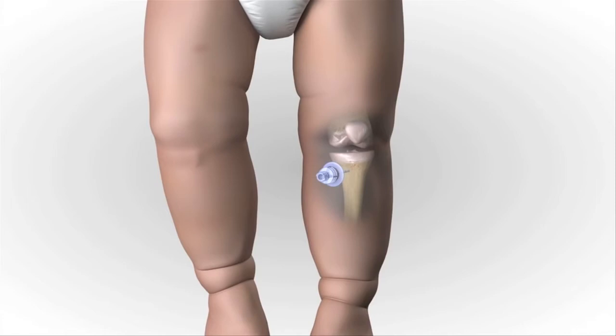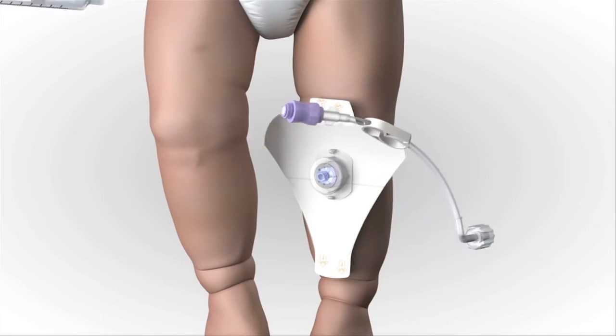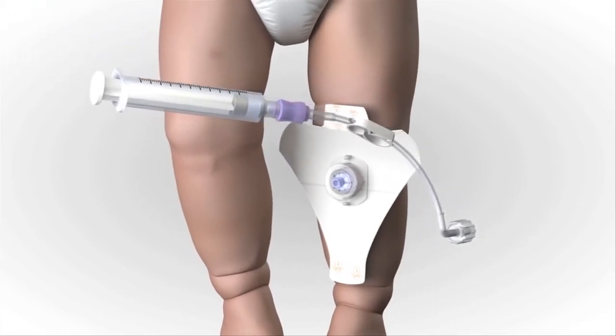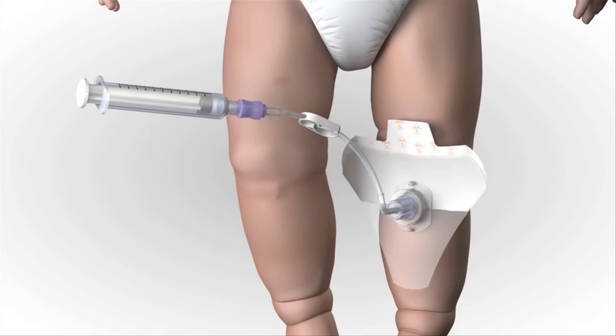Place the stylet in a sharps container. Place the Easy Stabilizer dressing over the hub. Attach a primed Easy Connect extension set to the hub. Firmly secure by twisting clockwise. Pull the tabs off the dressing to expose the adhesive, then apply to the skin.